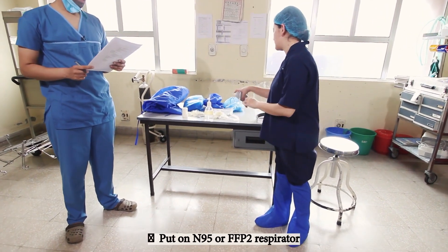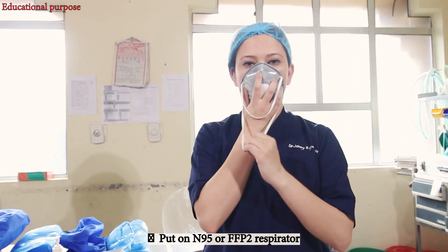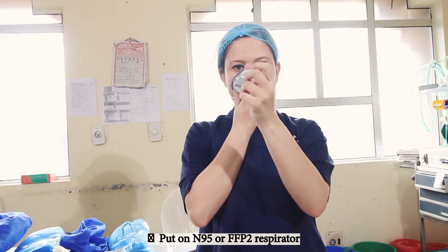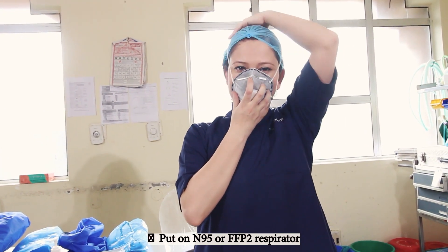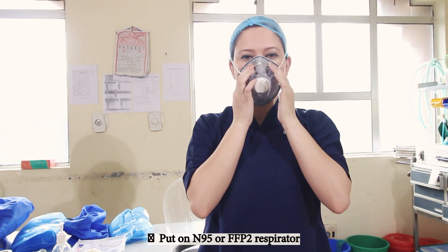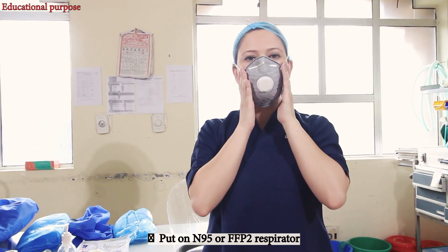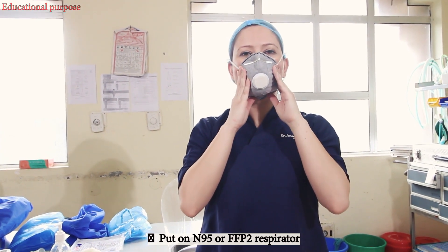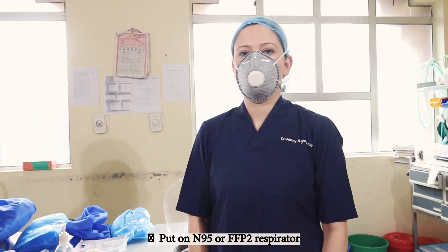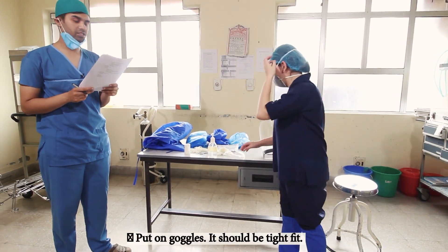Hold the mask to cover the nose and mouth. Pull the lower strap and take it over the head below the ears. Pull the upper strap over the head and over the ears. Check if the straps are tight fitting. Press over the nose piece and over the cheek for a tight fit. The lower portion of the mask should go below the chin. Blow out forcefully — air should not come out of the mask or around it. Do not enter the patient area if it does not fit properly. Now put on the goggles and check if it's a tight fit.